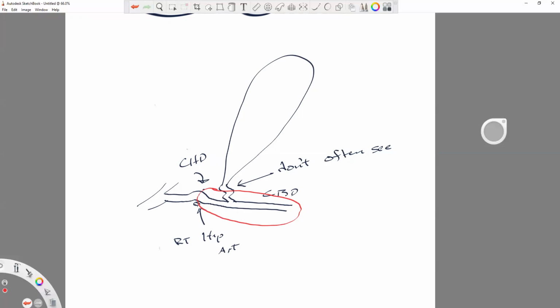Everyone does it. We all do it. But beyond the hepatic artery, higher up into the liver, we definitely want to call it common hepatic duct. So this is all common bile duct down here, even though from here to here it's actually still common hepatic duct, but we're going to go ahead and call it common bile duct when we do a lumen only measurement. All right.